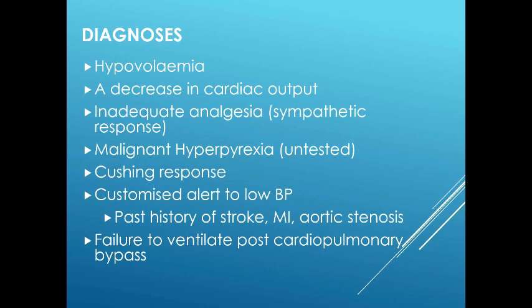The algorithm for the detection of MH is based on the time series data of 3 known cases. It is impossible to say whether it will detect all cases, as the presentations can vary, and it has not been used in the presence of an MH episode.